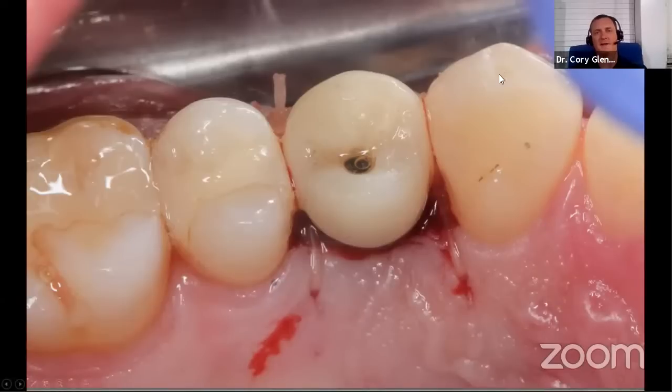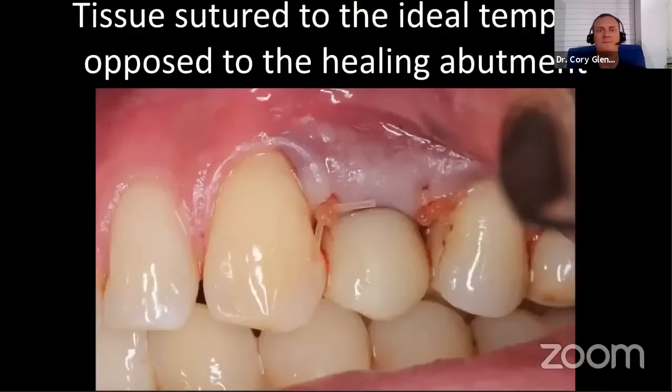It's all integrated. So I just thought that was an impressive workflow to be able to guide the implant, place it, and deliver the final restoration on the same day and the accuracy be so good that everything would fit. That really, to me, attested to the power of guided surgery and the Blue Sky kit, as well as these softwares, the guided software and the crown and bridge. Okay, that's how he was sutured up.